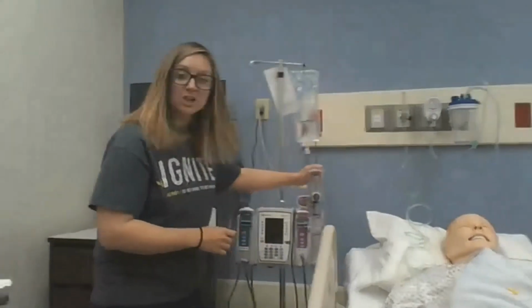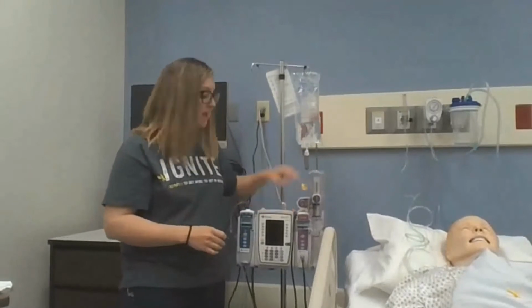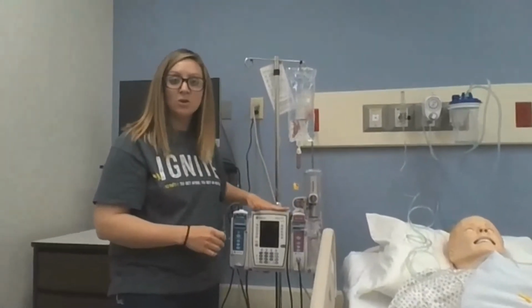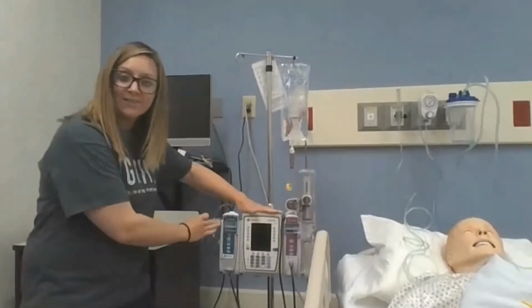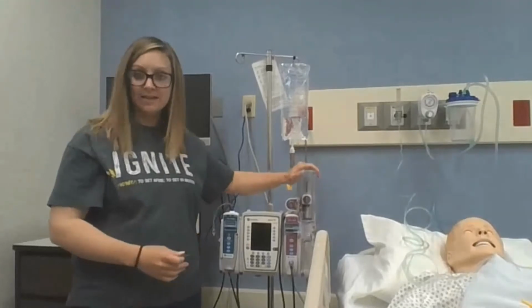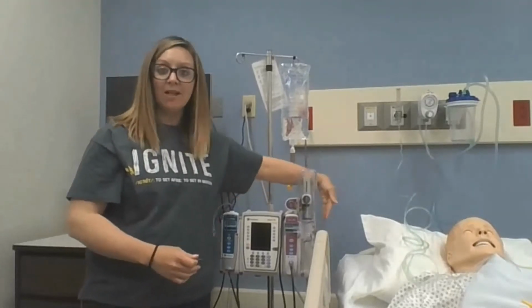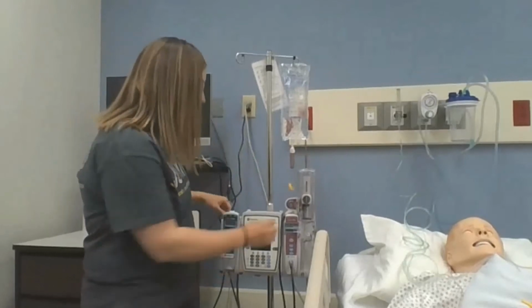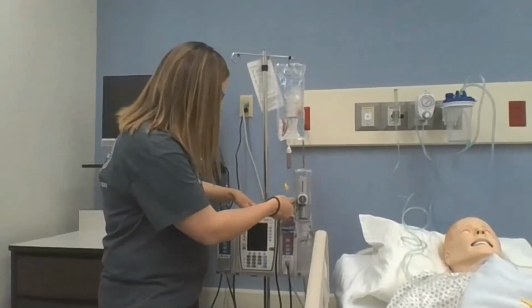So on your Alaris pump, on your brain, the PCA has to connect right next to the brain. So you can't have this on the outside of another channel. The PCA chamber could not be over here. It has to be connected directly to the brain. And then your yellow CO2 chamber will be right next to that. So you're going to make sure that your key is in here.